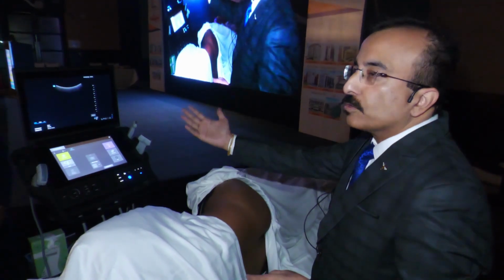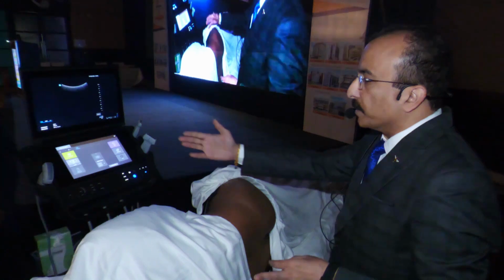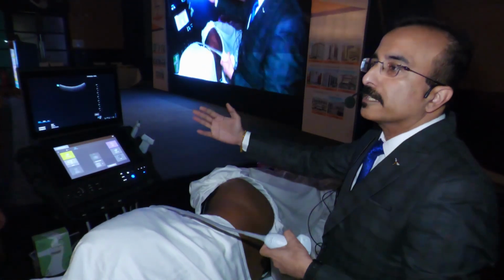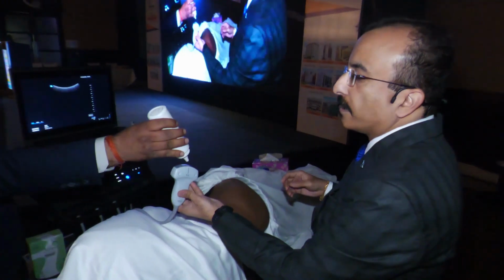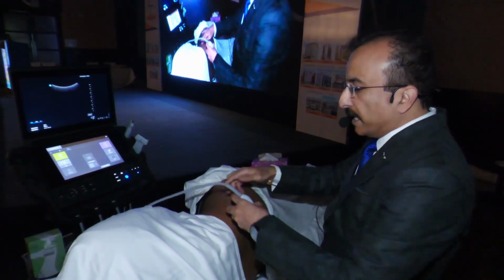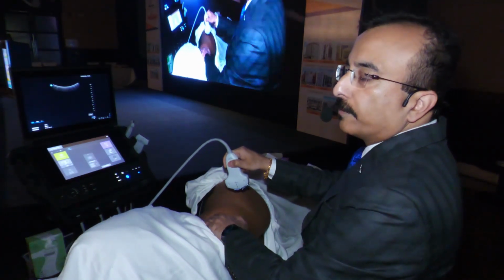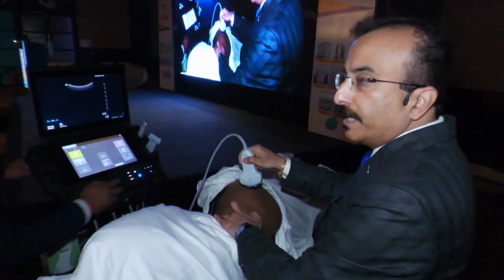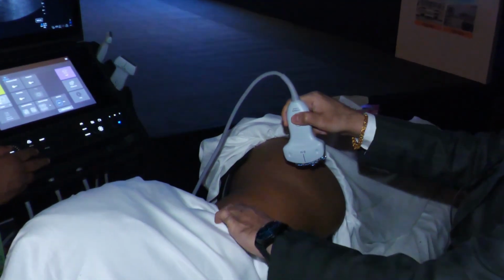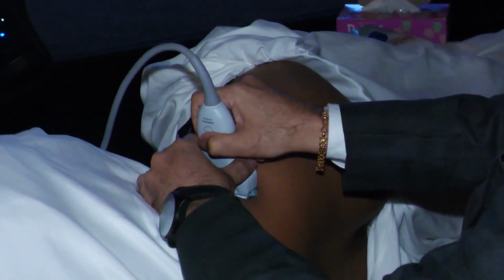The machine has to be in front of me, and I'm going to use a curvilinear probe because these are deeper structures. So what we are going to use is the Sonosite PX machine, which I call a Mercedes-Benz, because the resolution is too good. The initial probe placement for the shamrock technique for quadratus lumborum, or for that matter lumbar plexus, is between the iliac crest and the costal margin. I am feeling the iliac crest and the costal margin. So can you focus the camera person? Yes. So I'm going to place my probe in between these two structures.